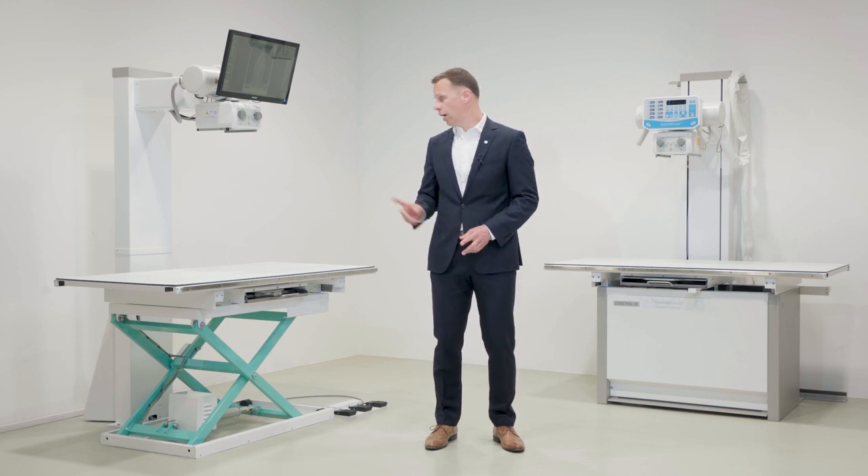We have here today our ZoomX Gold and ZoomX White systems. Both are extremely dependable, high quality, digital or digital ready systems that are in use in dozens of countries around the world.